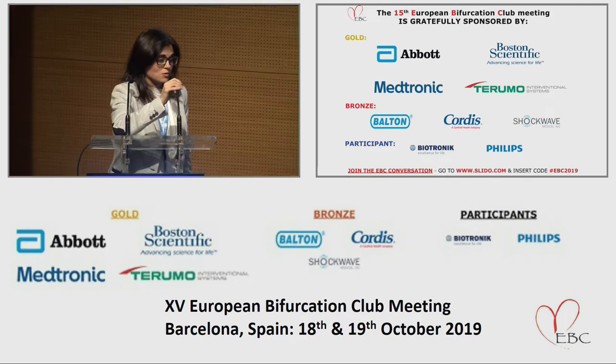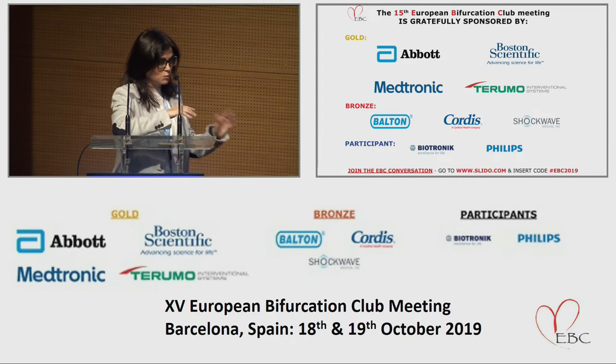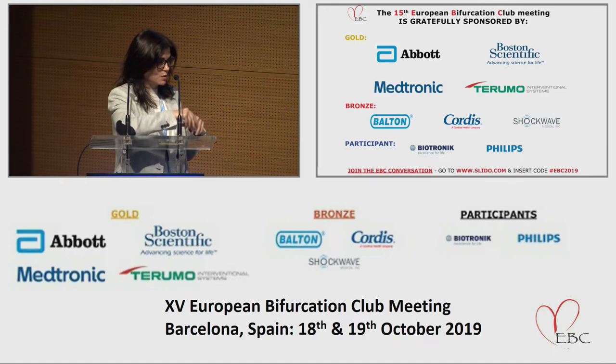Yeah, that's true. I mean, sometimes if it's very calcified, the catheter won't cross. I would say that usually what makes it more difficult is when you have a combination of curves and calcium. Generally, if it's a more straight lesion, unless it is very tight, generally the catheter will cross.